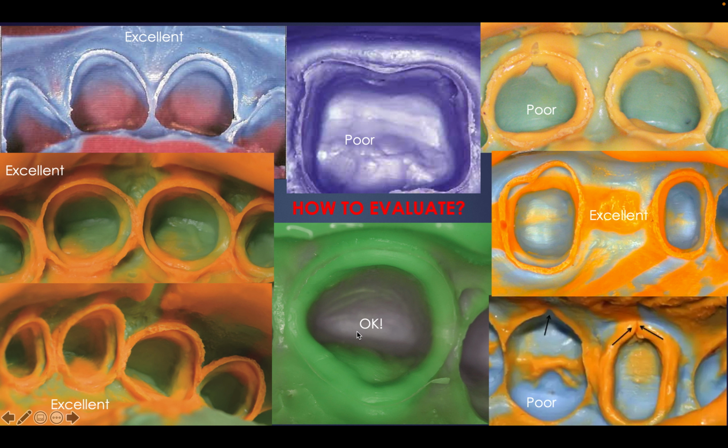So, this here is the tip of the tooth in negative impression. The bottom here is actually the impression of the incisal edge of this canine or incisor, correct? As you go upward here, this is your axial wall. And then as you come here, let's start on this one. Here, you can see clearer, this is your incisal edge. This is the tooth wall, correct? Mesial, buccal, lingual walls. And then there is a little horizontal area here. See? Tooth surface, this little horizontal area. This is your tooth margin.